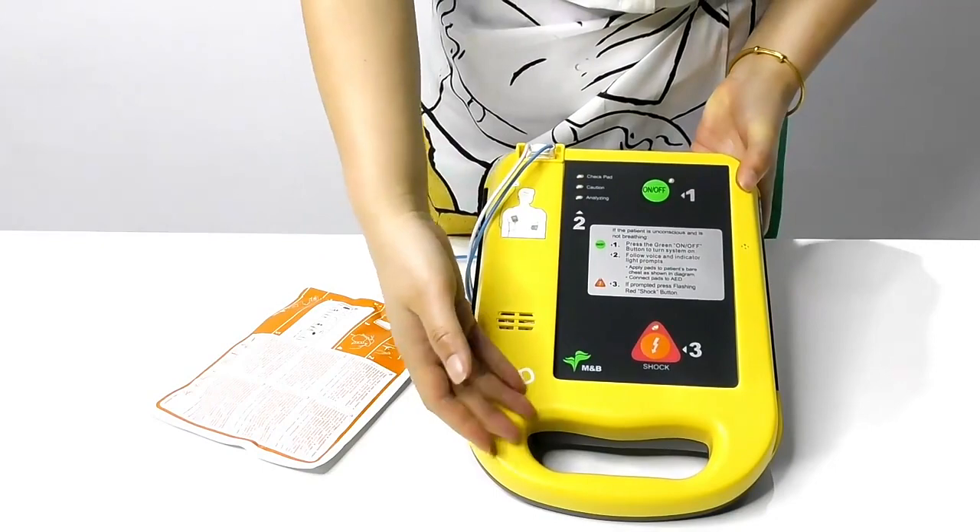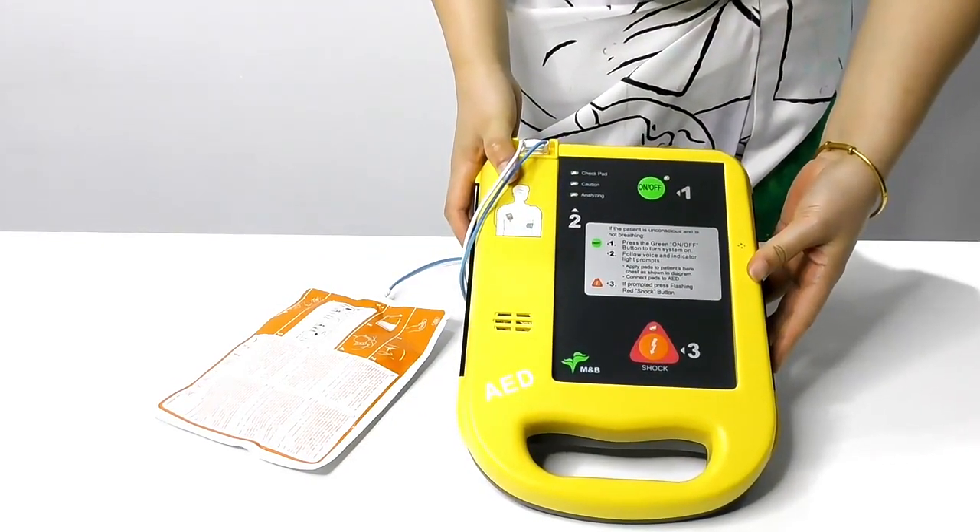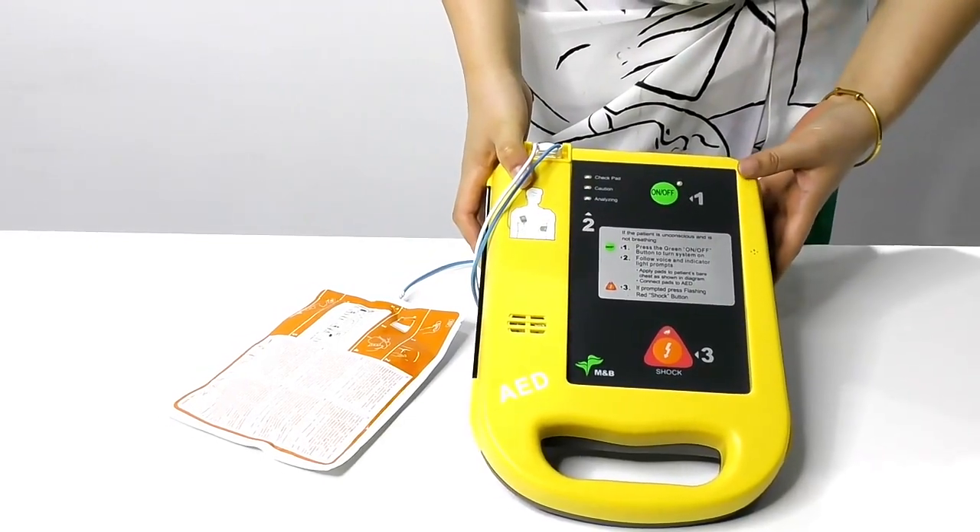Three steps to operate. If the patient is unconscious and is not breathing, we can use our AED-7000.